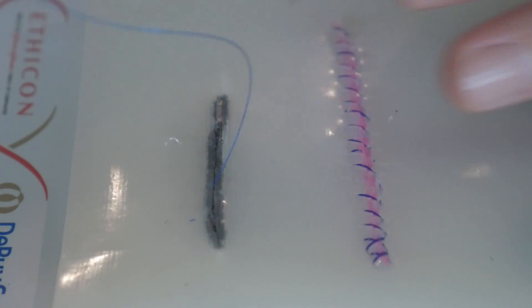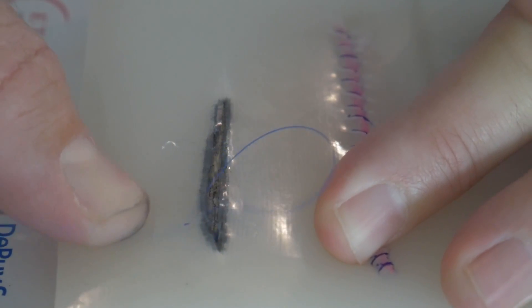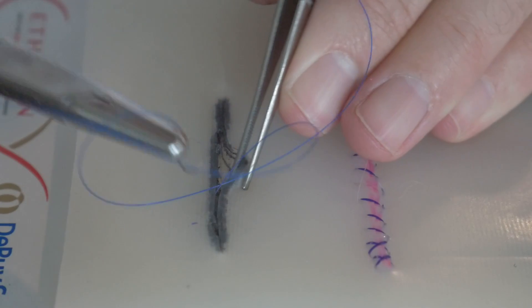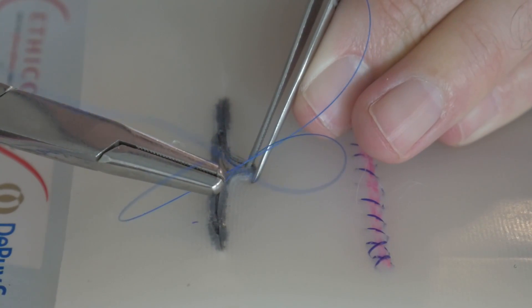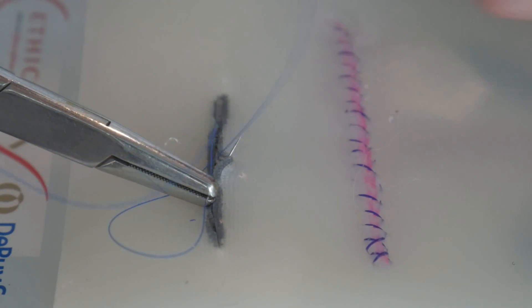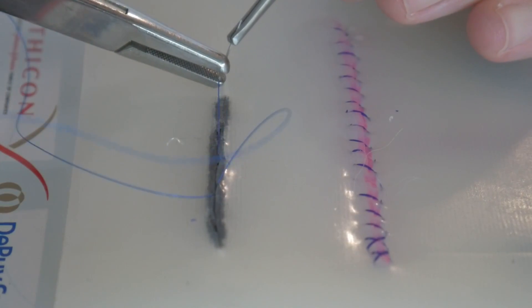And you can see right here, I'm pulling the incision apart. And you can see a nice ladder of stitches coming across. That's what you want. You want the stitches running at a 90 degree angle, left and right, left and right, left and right. And that's going to ensure a nice even closure as you're coming through.